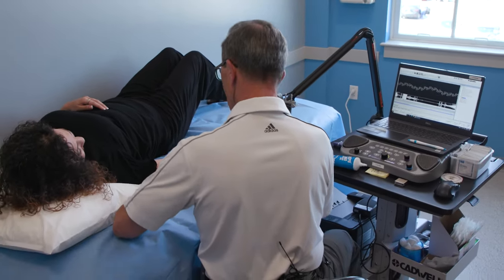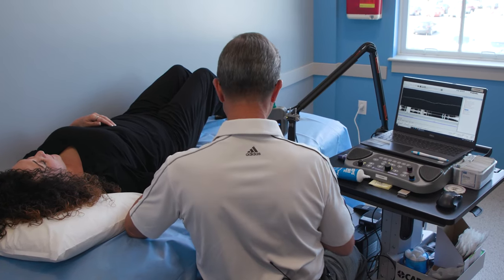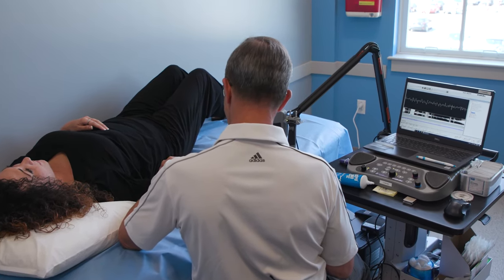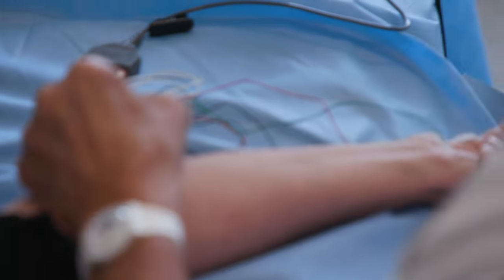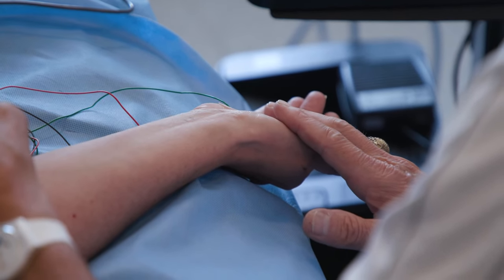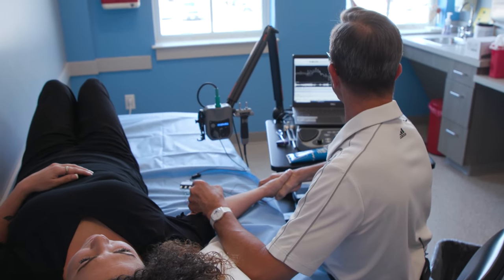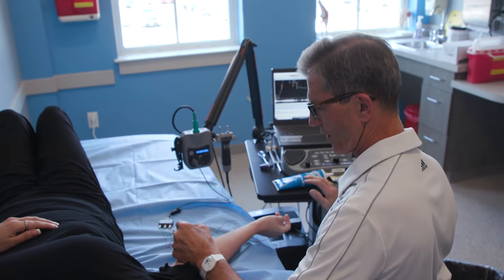You ready for one more? A little pinch. And slightly push your thumb up against my finger, a little bit harder each time — just keep pushing harder and harder. Now just push up a little bit. And I'm going to shake your hand and try to twist it this way — I want you to resist me. Just as I push against you, resist me. Perfect, and that's it.